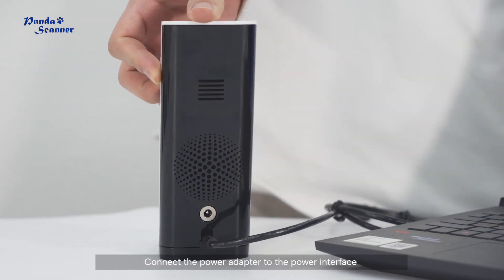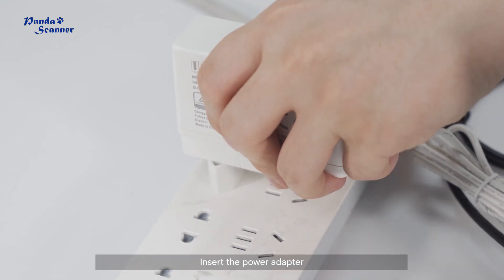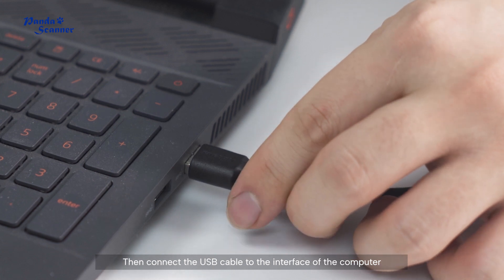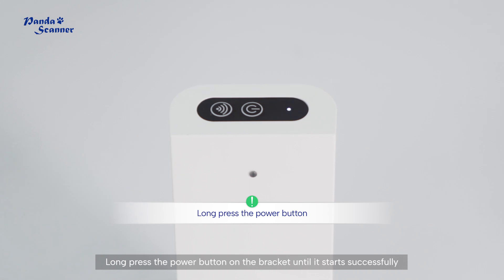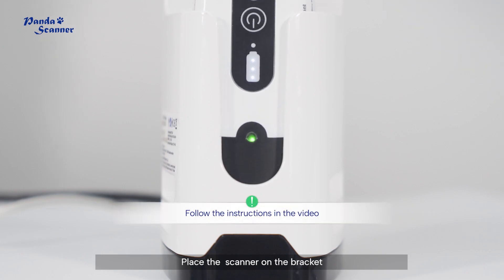Next, I will demonstrate how to connect the device. First, place the bracket and connect the power adapter to the power interface. Insert the power adapter, then connect the USB cable to the interface of the computer. Long press the power button on the bracket until it starts successfully, then press the power button of the scanner and place the scanner on the bracket.